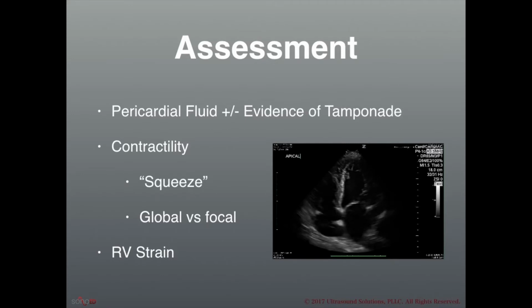So you'll often just hear us refer to it as pericardial fluid because clearly, we're uncertain just based on the ultrasound what exactly the fluid is. And then we're going to look for signs of tamponade.